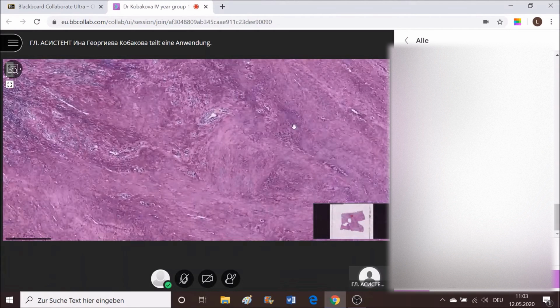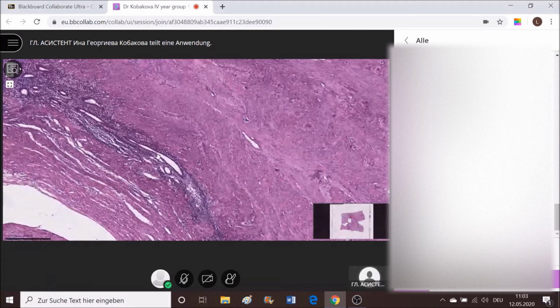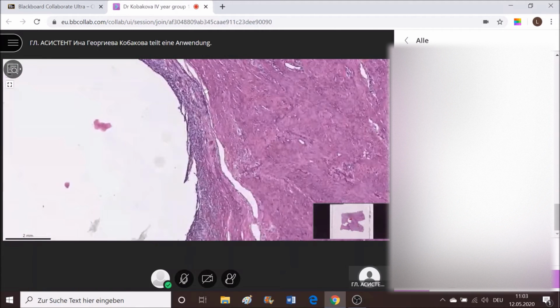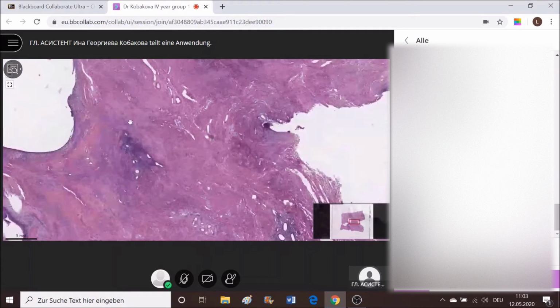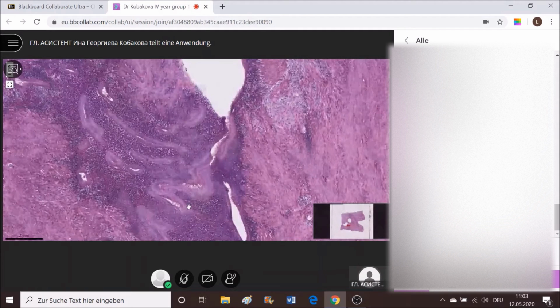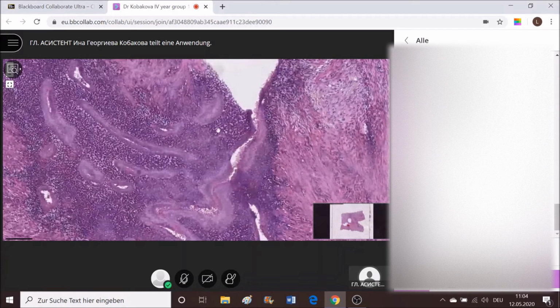And in between these smooth muscle cells, we observe small fibers of stroma with glandular structures, some small portions of inflammatory infiltrates. A cystically dilated one, which is found here. Further, again, a very well observable region of glandular appearance here.